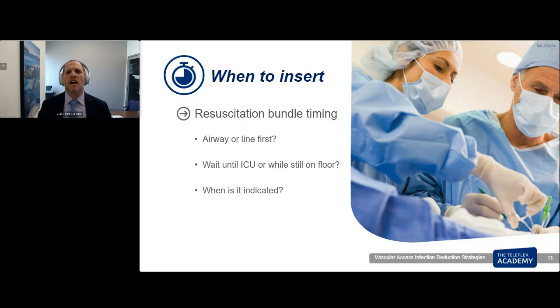Should you wait until you get to the ICU or do it while you're still on the floor? Well, again, let's remember what supplies are available to me on the floor. Is that staff used to somebody placing a central line? What is going to be the safest thing for the patient? The reality is I can put in an IO in 99.9% of patients within 10 seconds, extremely easily.